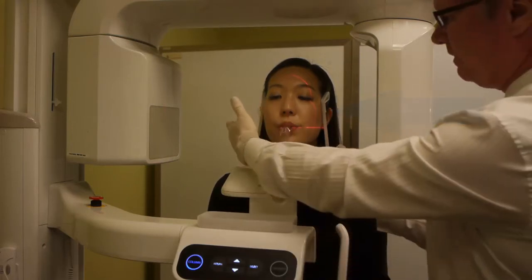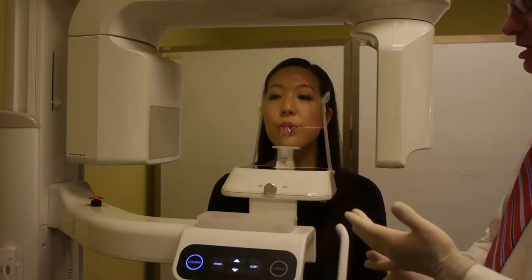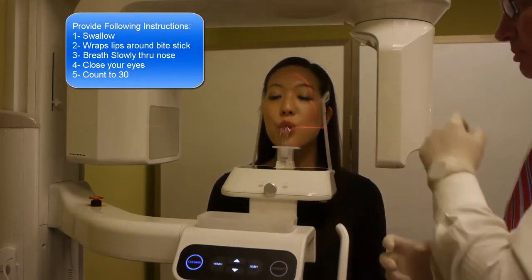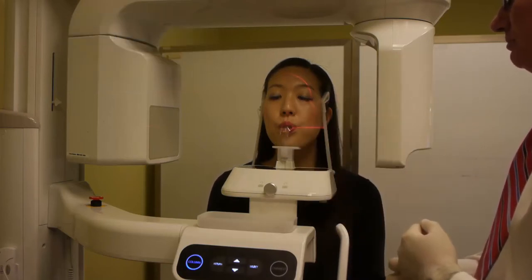And once they're tightened, apply pressure here to increase our stability. The last thing we do before we capture our image is provide our instructions. Go ahead and swallow. Wrap your lips around the bite block like you're sucking on a straw. Breathe slowly through your nose. Close your eyes and then count to 30. And that's it.